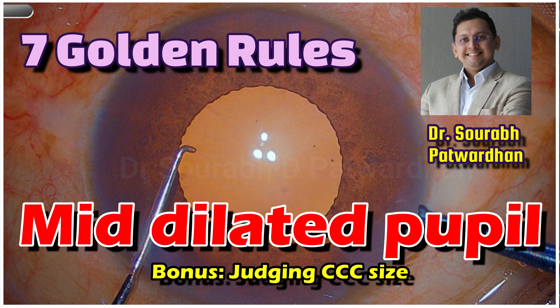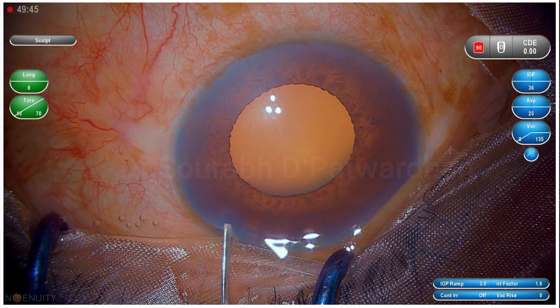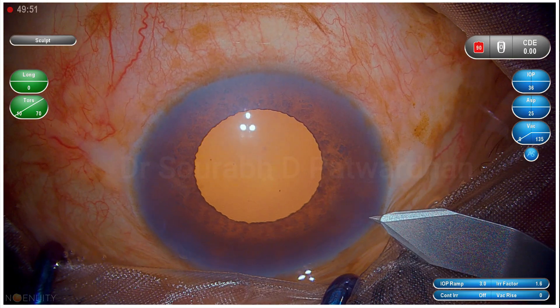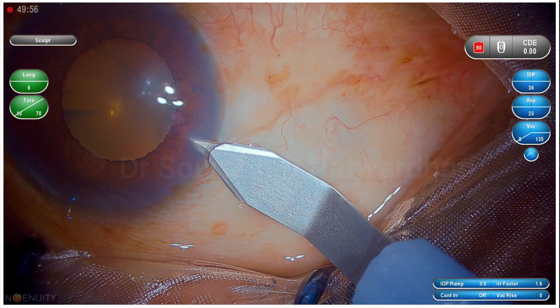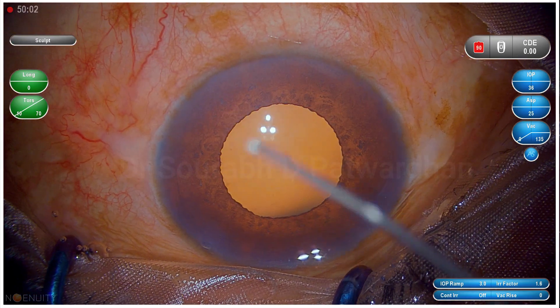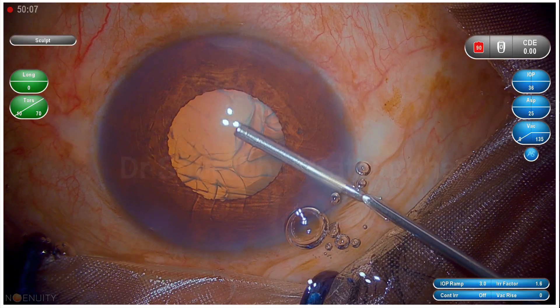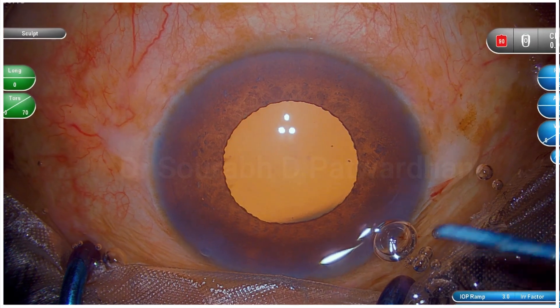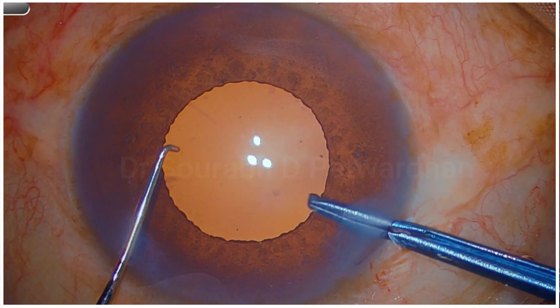This is a mid-dilated pupil — you can see that it's not too small, so we can go ahead with the surgery without use of the pupil expansion device. Now the first thing is you should have a proper incision; you should not have a very short incision because in these cases iris prolapse is very common. Once I put visco, you can notice that the pupil didn't expand that much, which is a good sign indicating it's not very floppy and will stay as it is throughout the surgery.